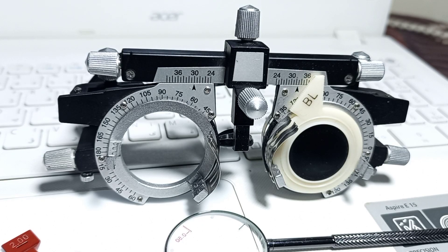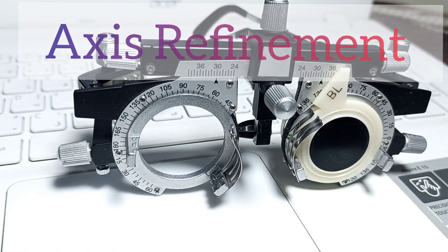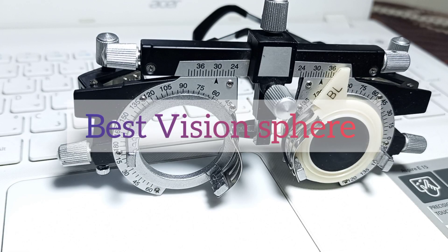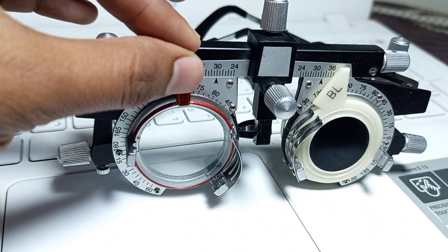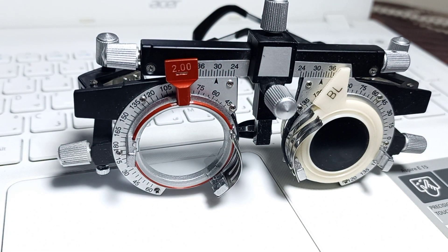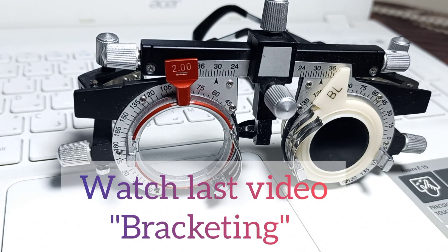Now we will learn about the second step of the Jackson Cross Cylinder procedure, which is called axis refinement. As you know, the best vision sphere of our patient was minus two spherical, so minus two spherical is our best vision sphere.